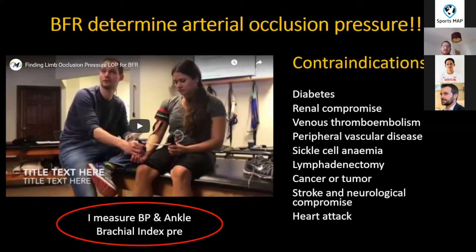So basically you have the inflatable cuff. For us, it'll be at the top of the thigh, and you'll have a handheld Doppler, and this will go on the posterior tibial artery behind the medial malleolus, and you inflate it until you can't hear a pulse on the handheld Doppler.